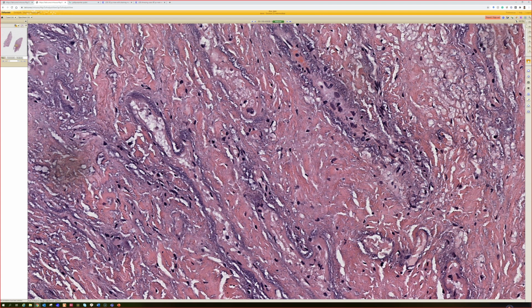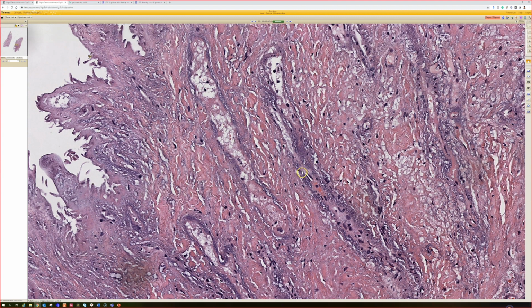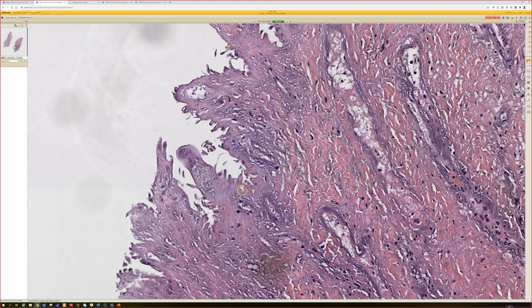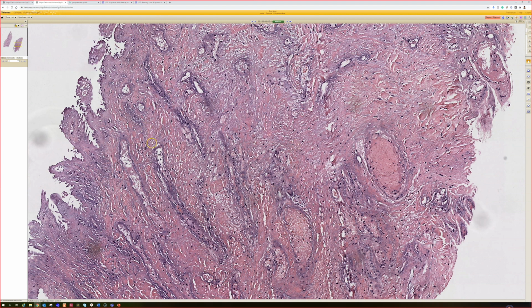There's other forms of ecthyma, which I think is staph or strep, if I recall, kind of punched out necrotic eschars in the skin. And my understanding is that this is more common in like HIV or immunodeficiency setting. But again, I've never actually seen it in real life, just in study sets and educational material. The key is that the skin begins to die, right? So this is maybe not quite dead yet. To paraphrase Monty Python here, this is not happy tissue, right? This is on its way out.